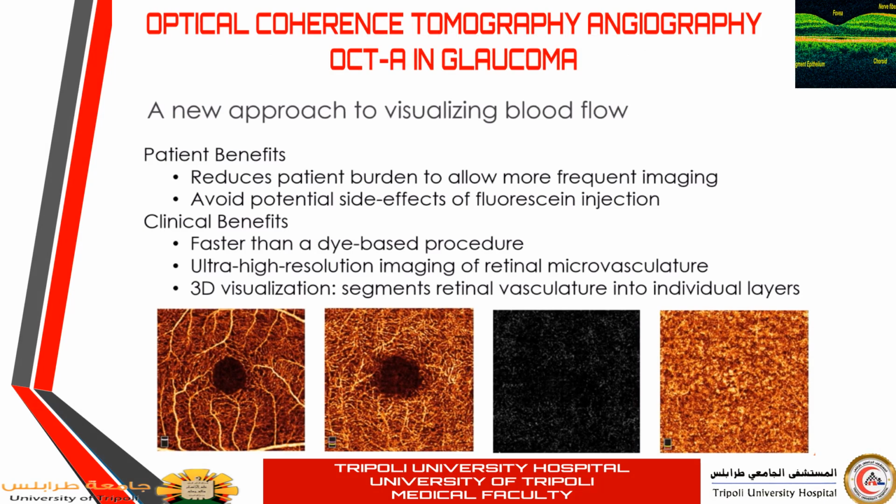So the optical coherence tomography angiography is a new approach to visualize the blood flow, and it has a greater advantage to the patients and to the clinical practice. To the patients, reduced patient's burden to allow more frequent imaging. So we can do frequent imaging of the patient without any burden for him, unlike fluorescein angiography. And there is no side effect from fluorescein injection, so it can be used in pregnancy and so forth.